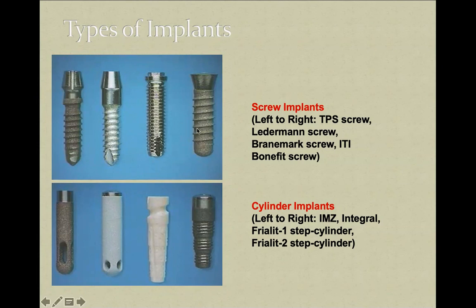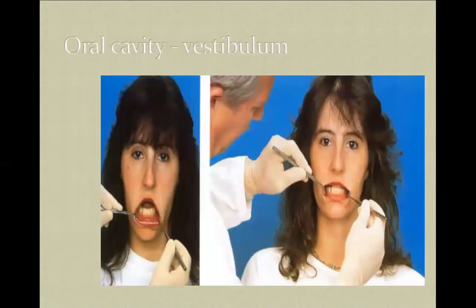With screw type implants, just recently we had a special instrumentation set that in 85% of cases gave a possibility to unscrew the implant by means of excess loading. So that is possible. That's what I'm doing, even for very, very strong ones. But sometimes you have to cut it out.